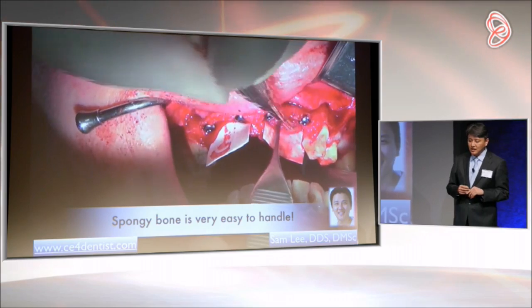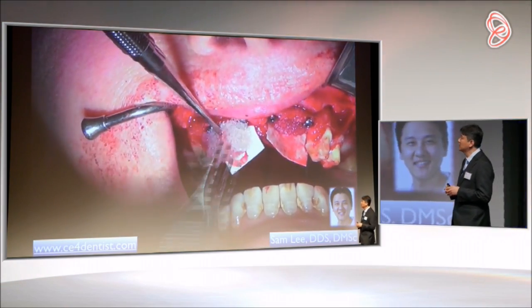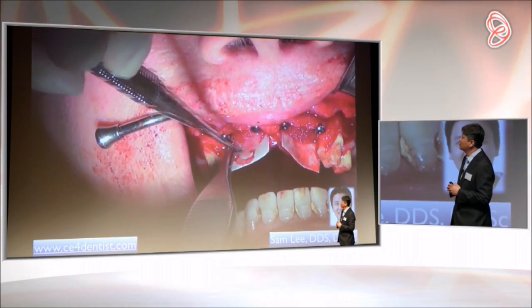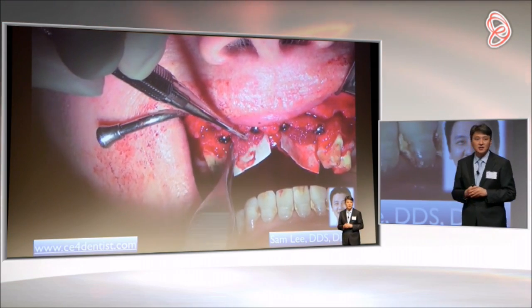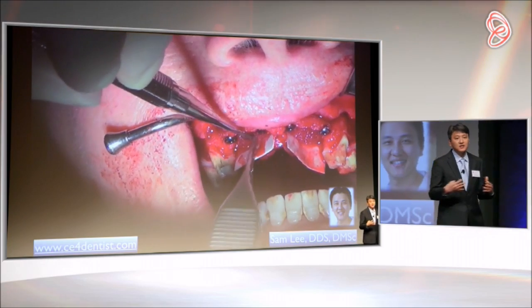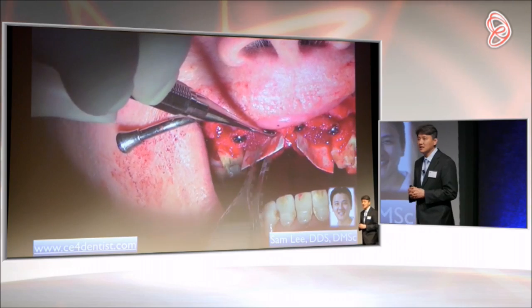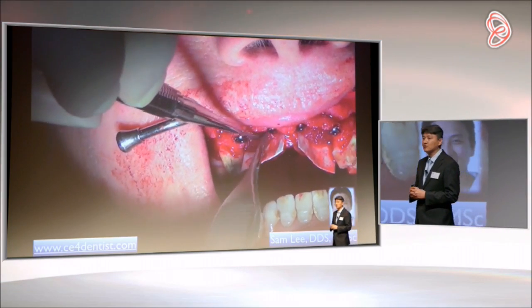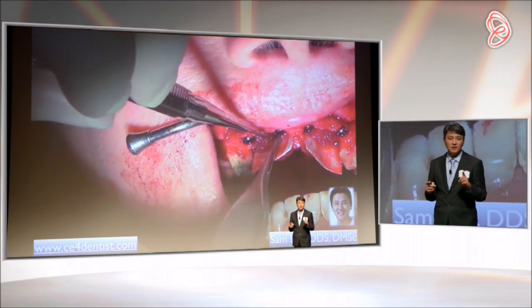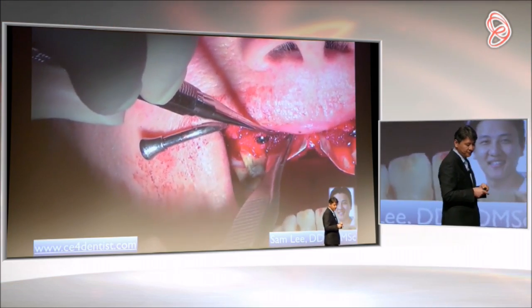So as you can see, all you have to do is really eliminate the wrinkles in the bone block. And because it's malleable, I'm able to put it in very, very easily. And because the palatal flap is very thick and rigid, there is no reason to use titanium reinforced membrane, and there is no reason to use non-resorbable membrane.